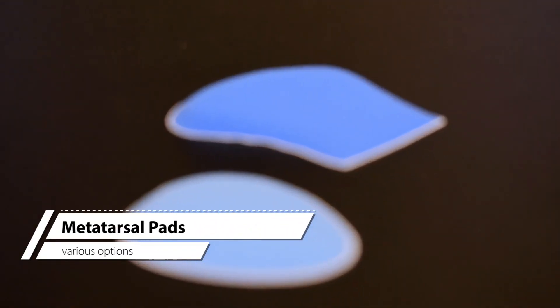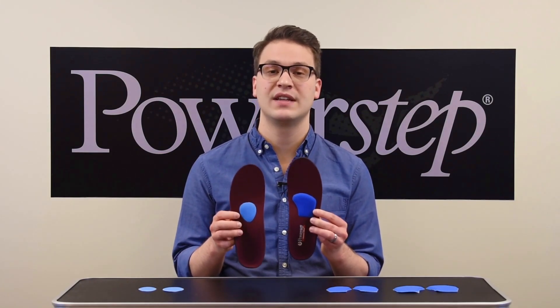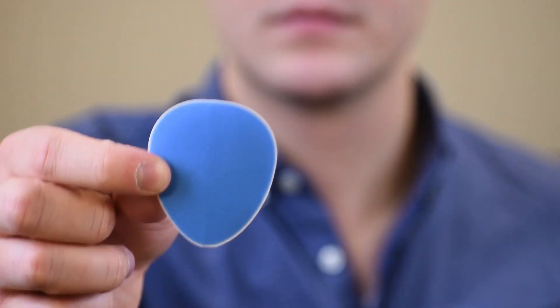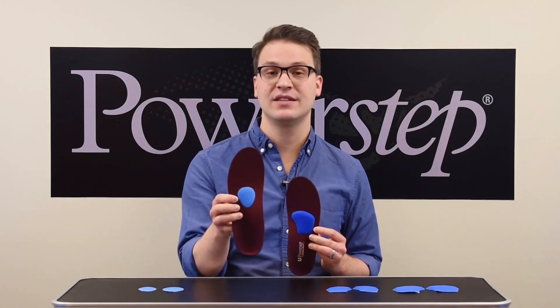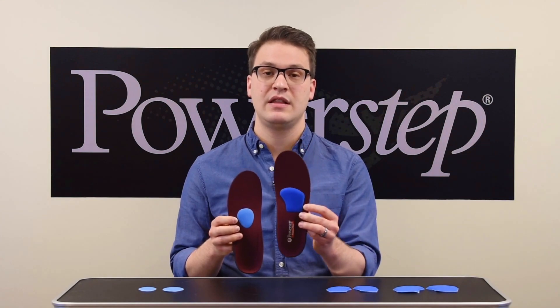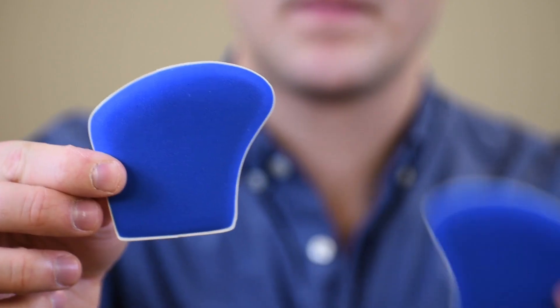Metatarsal pads are used to cushion and spread the metatarsal heads to alleviate forefoot pain like metatarsalgia and Morton's neuroma. We have two different styles: a met teardrop pad and a met cushion. The met teardrop pads are lower profile while the met cushions have a more prominent shape. These both come in small and regular sizes, and the met cushions are left-right specific.